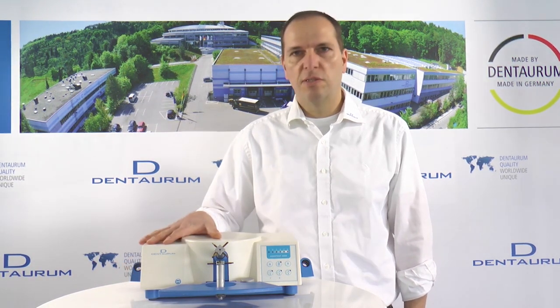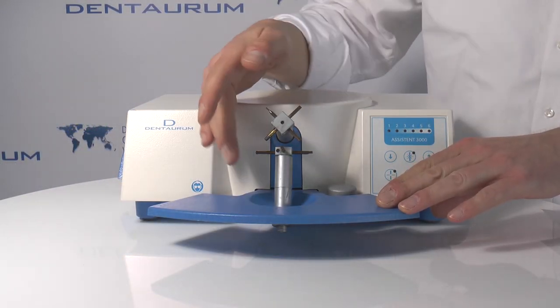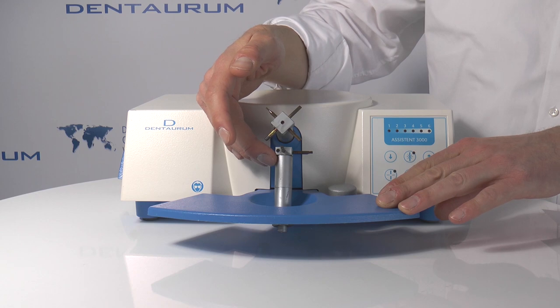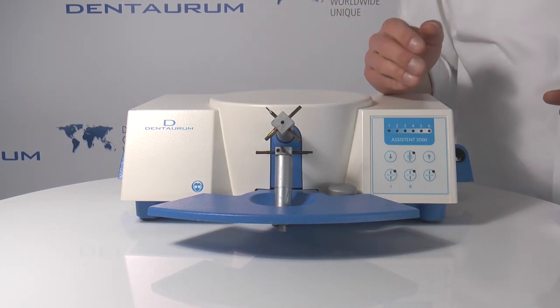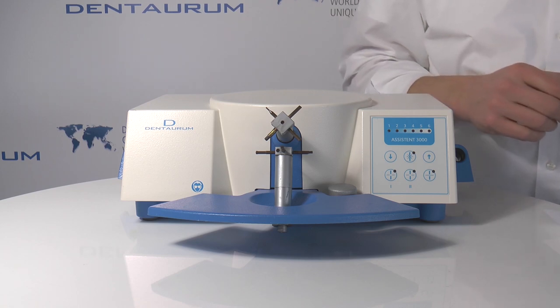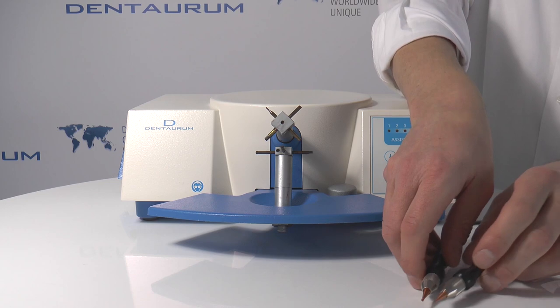So let's have a look at the Assistant. These are the upper and lower clickstop electrode holders you normally use for welding or soldering on the unit. As an alternative you can also use hand electrodes.